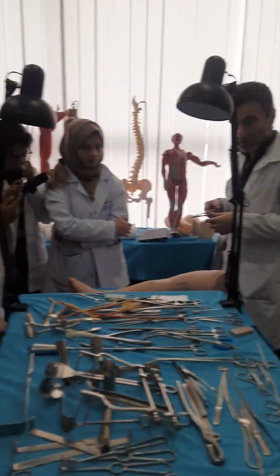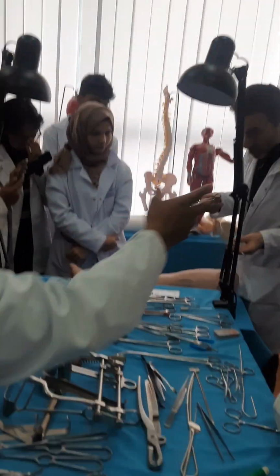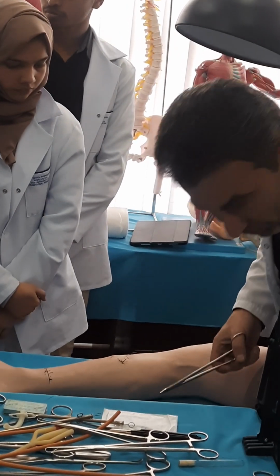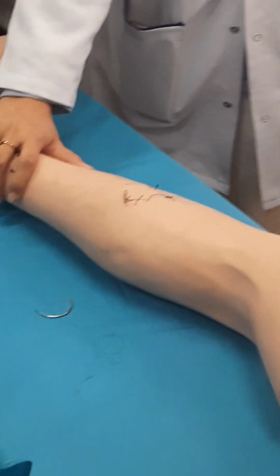Give me one dissecting forceps, please. Dissecting forceps. Thank you very much. In this position, let's take the smaller needle, for example this one. It's much more comfortable for us. Again, absolutely the same. It doesn't matter which kind of needle I fix, it is absolutely the same way. You see? And don't work with the open instrument. Close the lock. Otherwise, you can lose your instrument during your work. Now, if it is possible, hold it to prevent any movement.